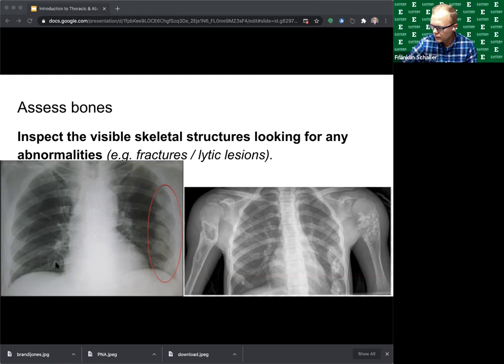And we're getting several responses from you guys. Thank you. Tina sees a lytic lesion. Kristen, left humerus mass. Kendall, humerus lesion. And Christina, right arm deformity of bone, perhaps arthritis. So I would agree with you guys.